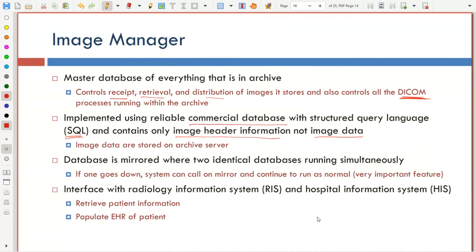because once you establish a PACS system, the storage itself is huge. Imagine that you're adding many terabytes of data to your storage every day. After a few years, it's extremely difficult to imagine that you're going to run any processes on all the images. It's much easier to look at the image metadata or the image header.